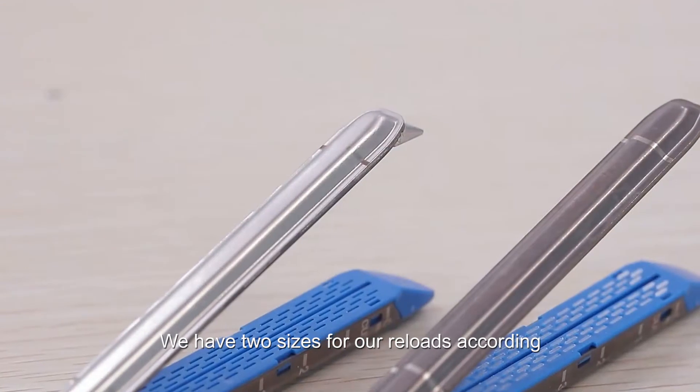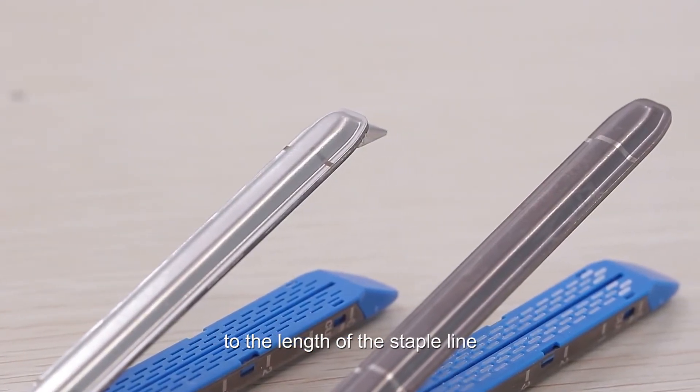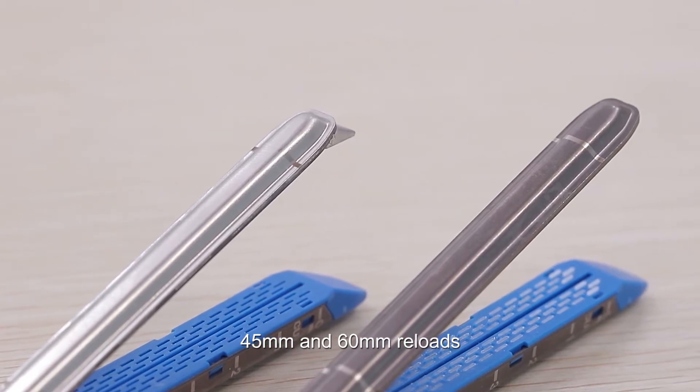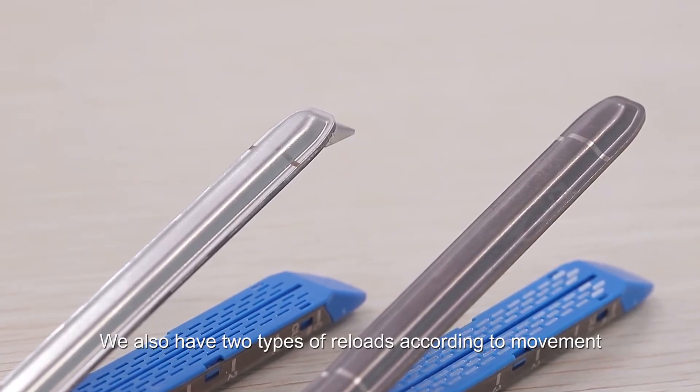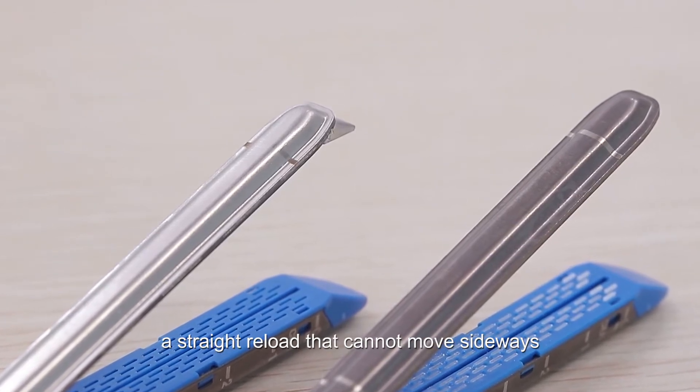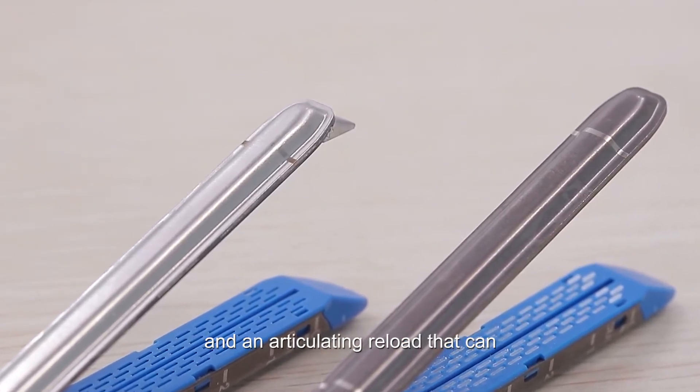We have two sizes for our reloads according to the length of the staple line: 45 millimeters and 60 millimeter reloads. We also have two types of reloads according to movement: a straight reload that cannot move sideways and an articulating reload that can.